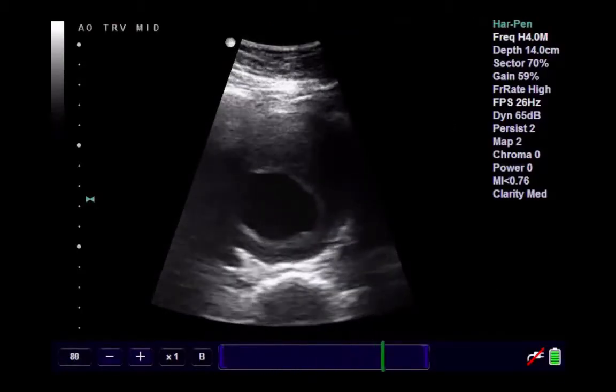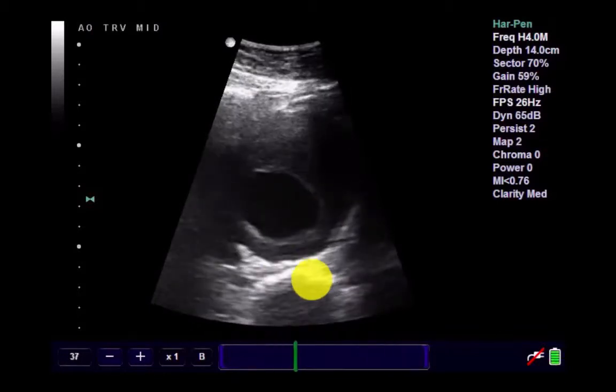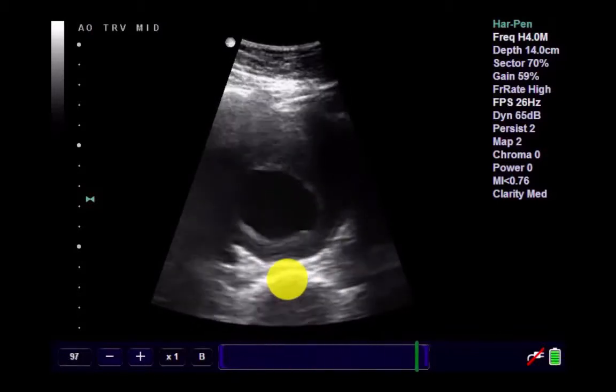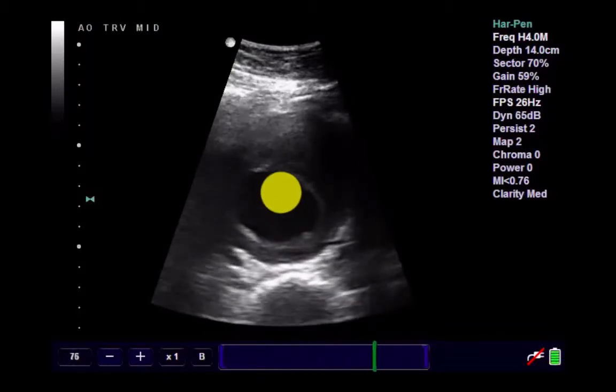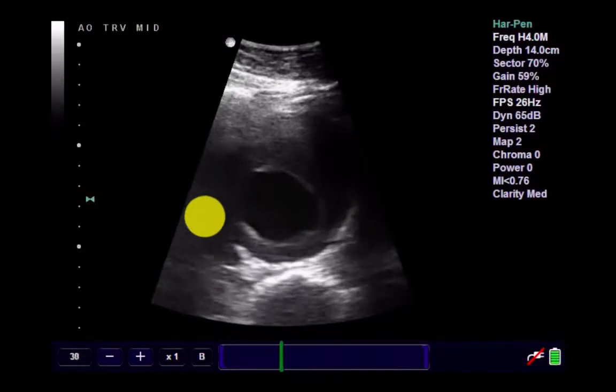Here's another example. This is more of a static clip. You can see another good shot of that vertebral body. All right, we're sure that this is the aorta. This is pulsatile, obviously. And that aneurysm sac goes all the way around here.